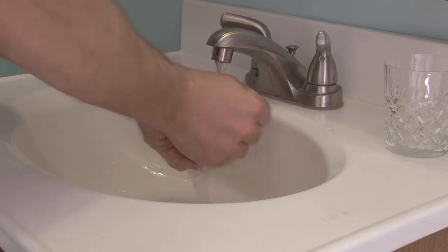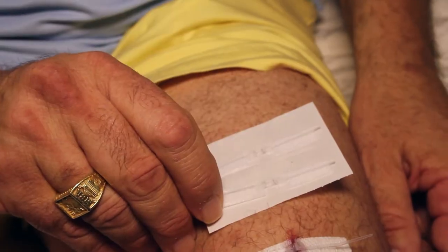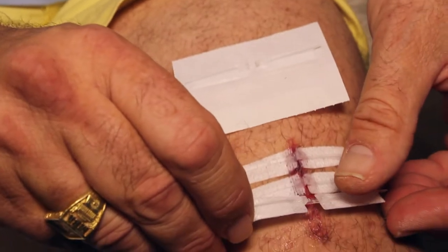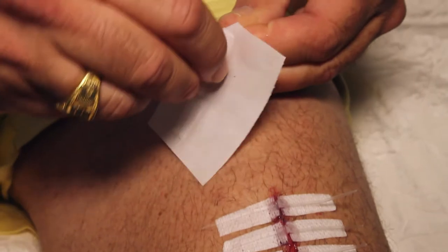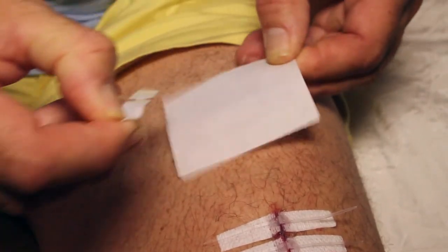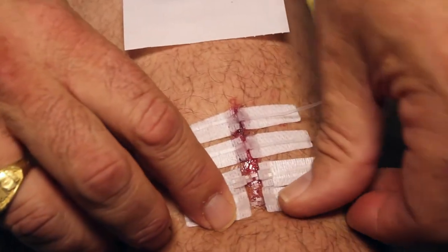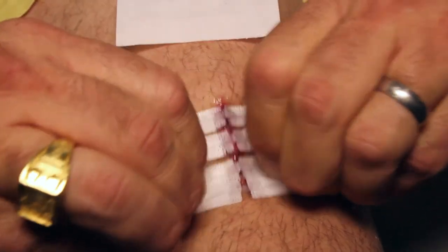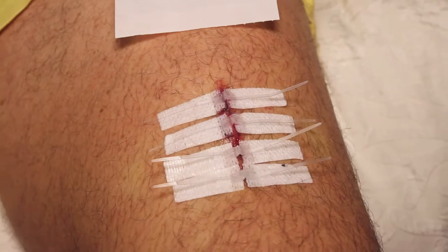Clean hands prior to use, then clean and dry the wound as directed. Remove the device from the package and carefully peel off the card — careful not to touch the adhesive with fingers. Place the device on each side of the open wound; the wound should be in the center of the device. Press down on each side of the strip to activate the adhesive, then pull the tabs in opposite directions and watch how the skin is closed.